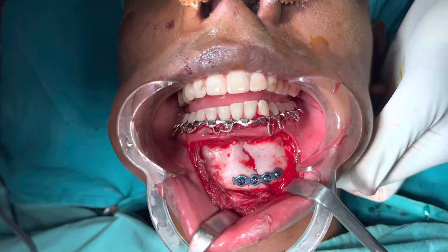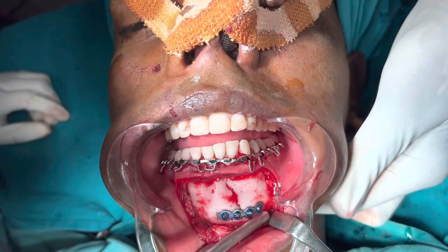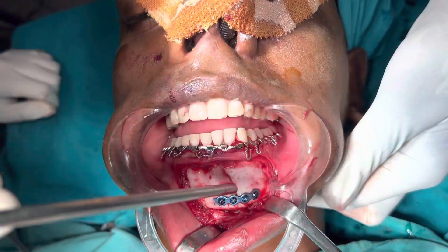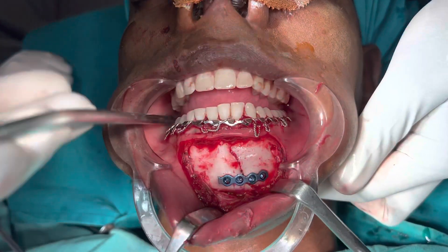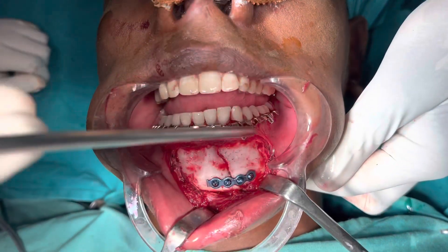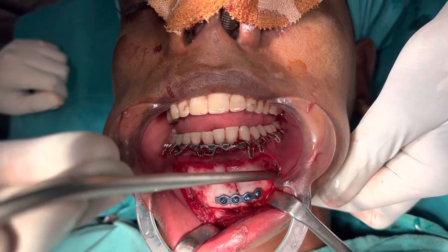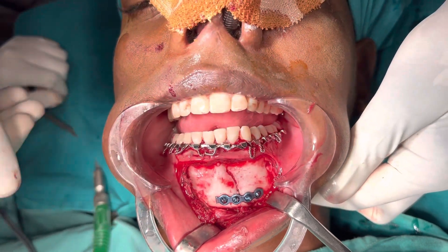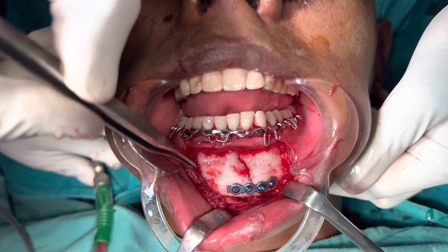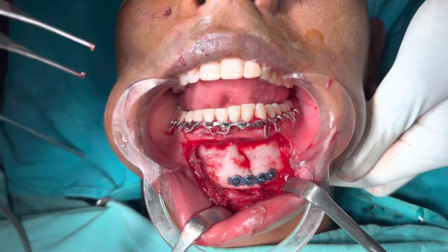We've used one four-hole plate — 2mm screw, four screws, 8mm — fixed at the lower border. We're not going to use another plate; it's not needed because it's not majorly displaced and we have an arch bar. That's the mental nerve on the left side. We haven't exposed from the right because the fracture is running slightly towards the left.